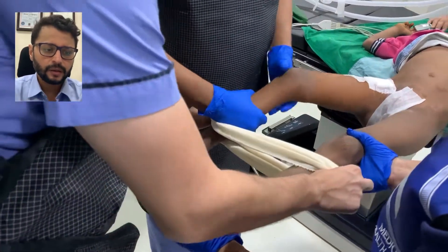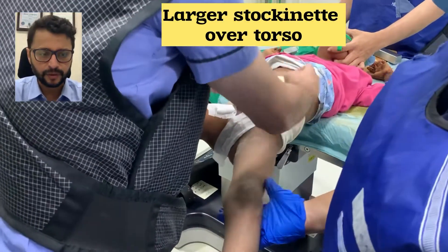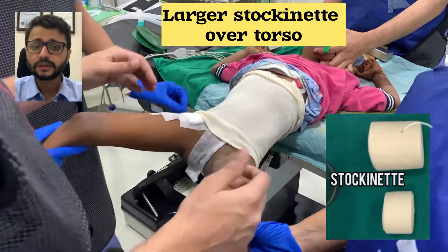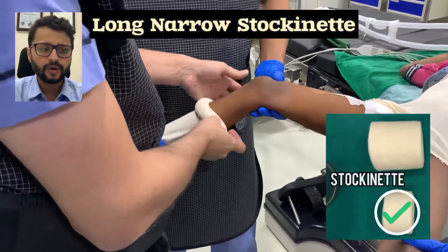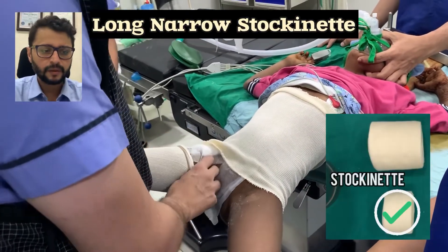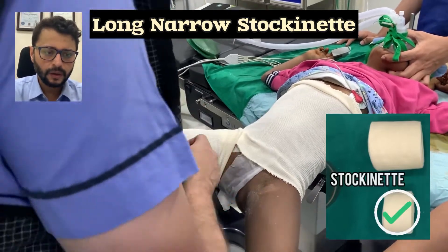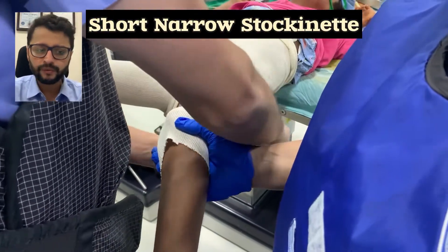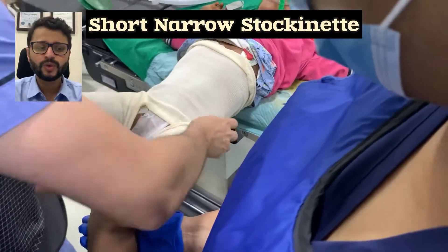Padding is very important using stockinette and soft roll. The big roll of stockinette — which is three inches in diameter — is stretched out to cover the entire torso. The long narrow stockinette, about 1.5 inches thick, is rolled from the level of the heel to the level of the groin. Another short narrow stockinette is rolled from the level of the knee to the level of the groin when doing a one-and-a-half hip spica, which is the usual approach.